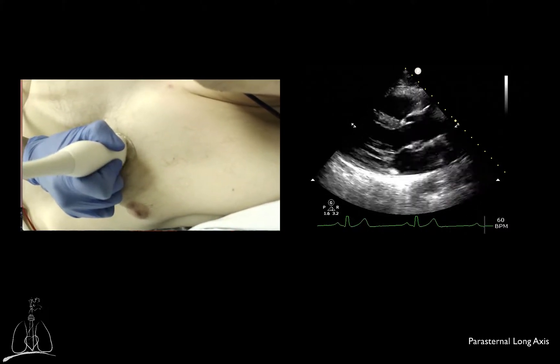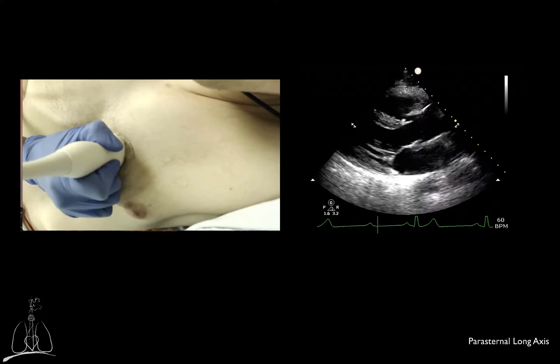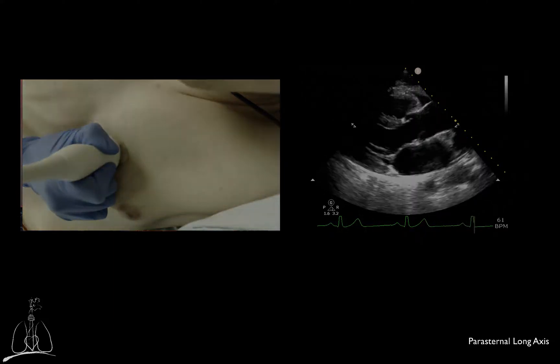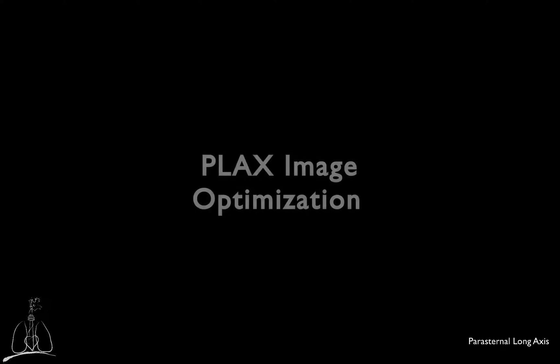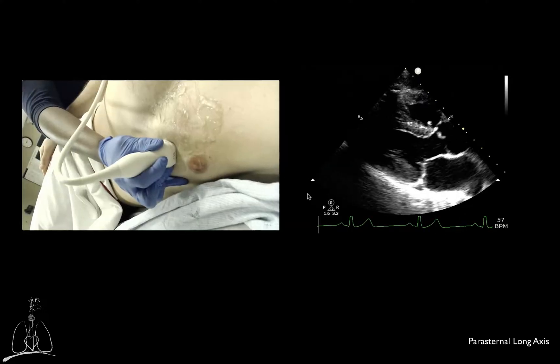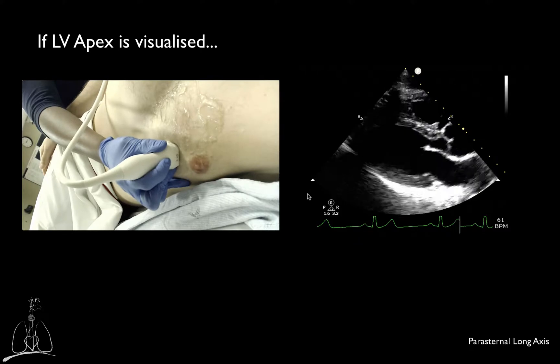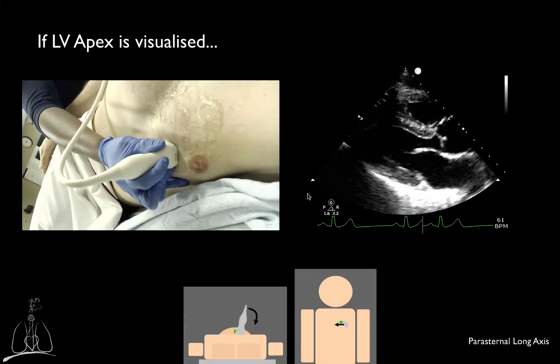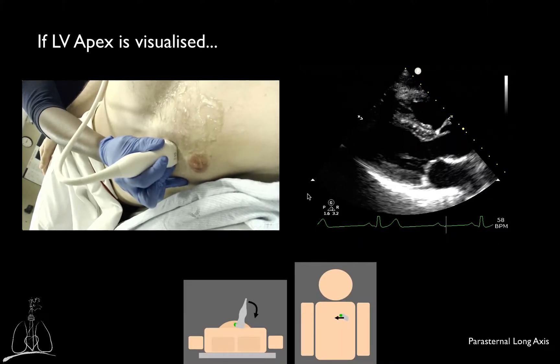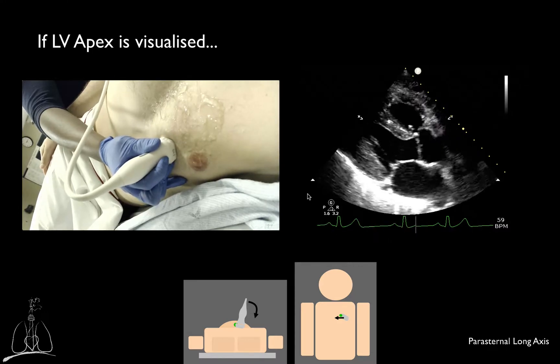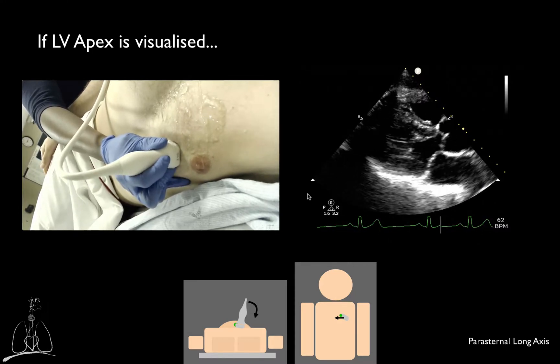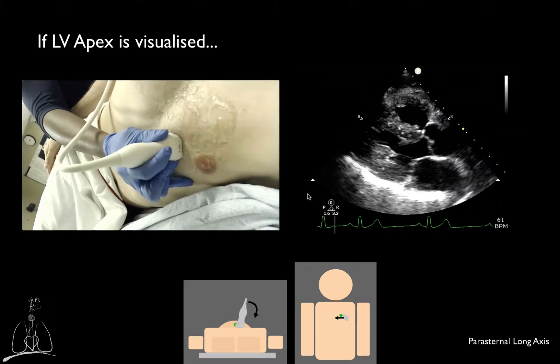Careful manipulation of the transducer will allow you to optimize the view in the vast majority of patients. If the apex of the left ventricle is visualized on the screen, two manipulations should be attempted: rocking of the probe towards the sternum, or sliding of the probe towards the sternum.